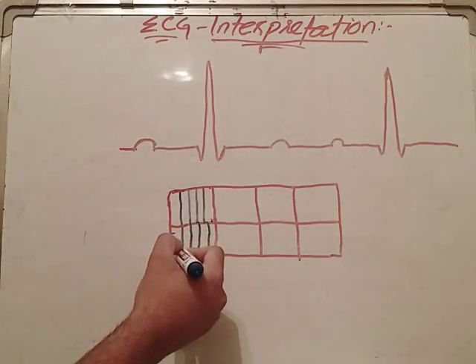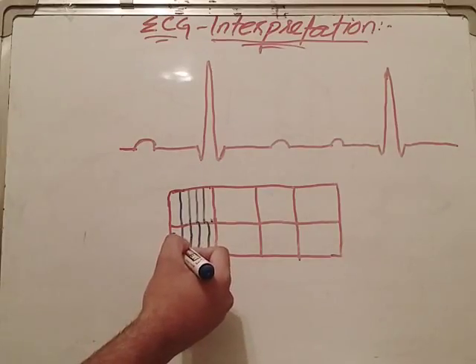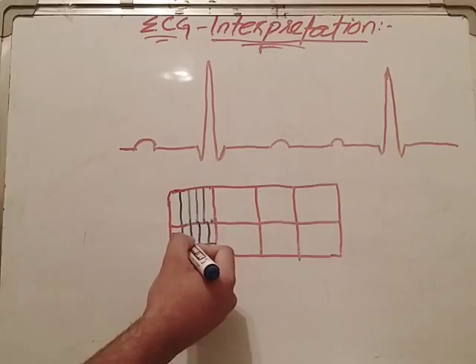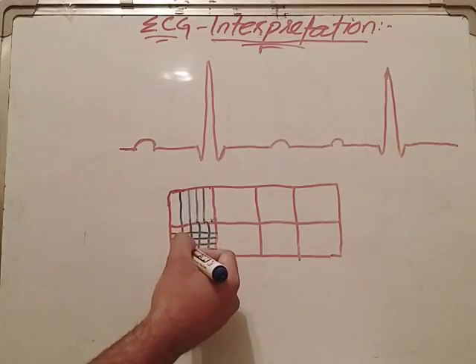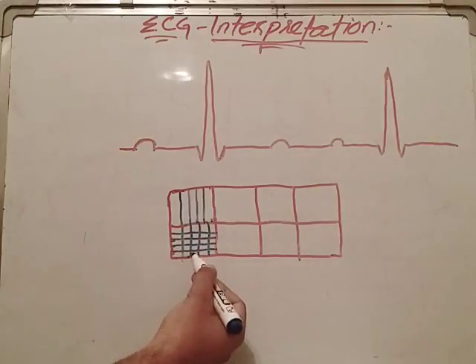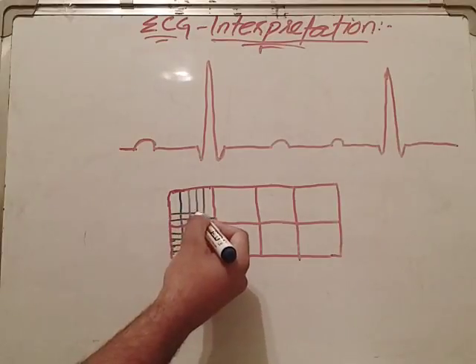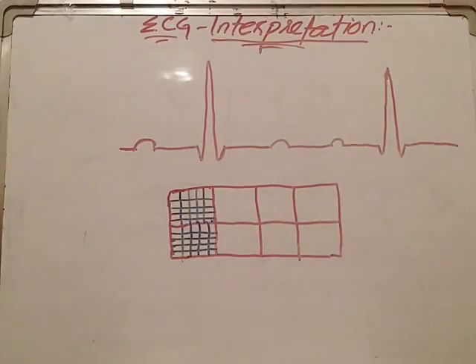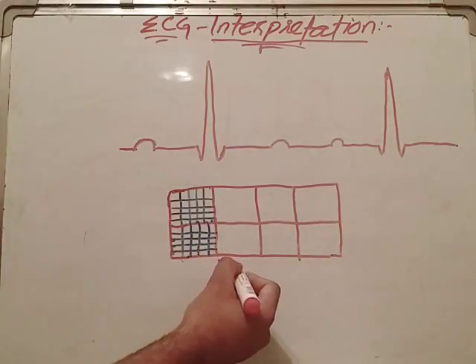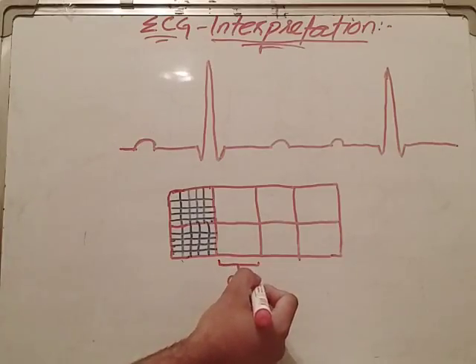Yes, so the distance of one large box is equal to 0.2 seconds.